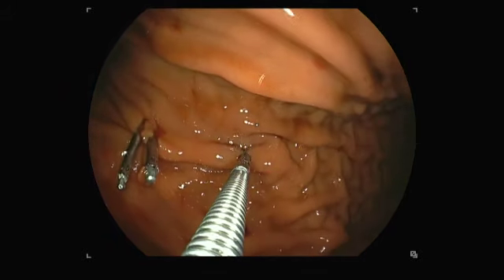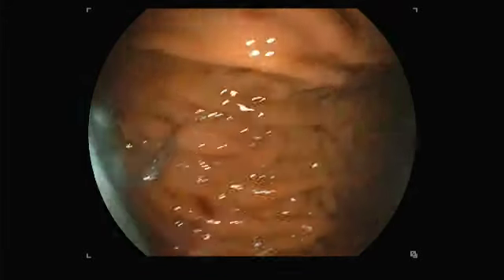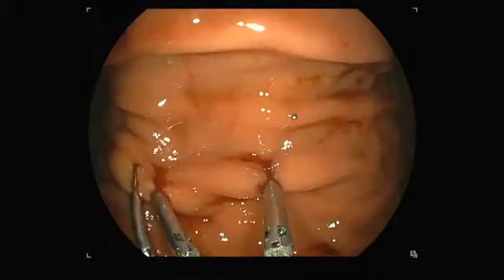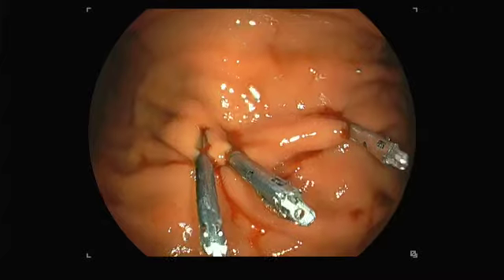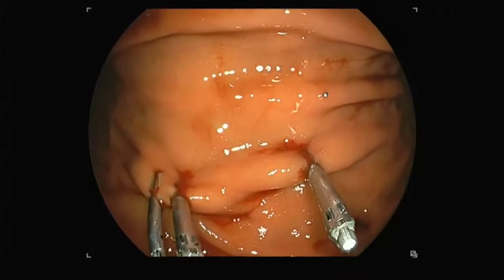Whenever you apply a clip, as you can see, I did not deploy immediately. I waited to confirm the bleeding had stopped, and then deployed the clip. That is an important principle in clip application that you should keep in mind.